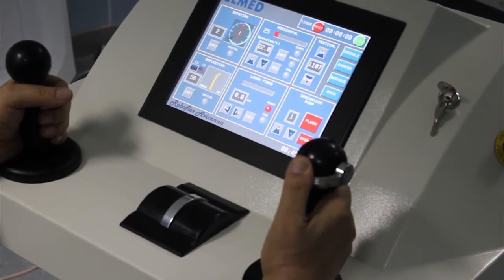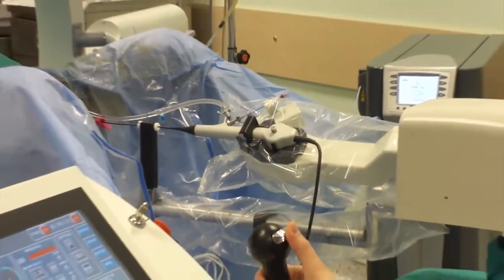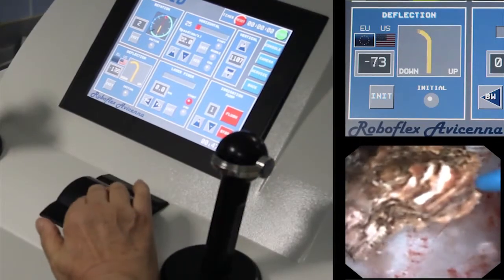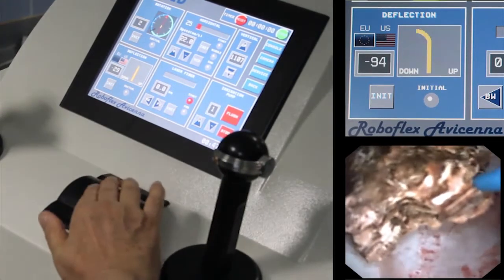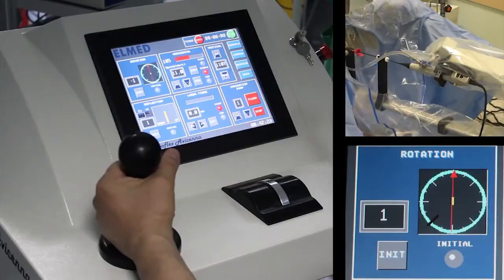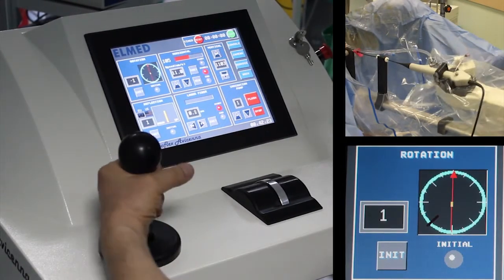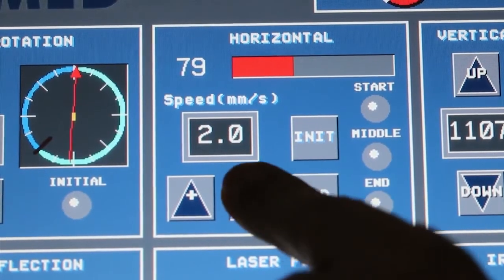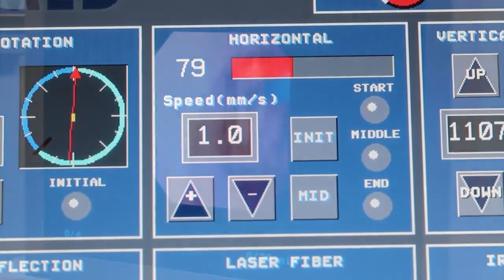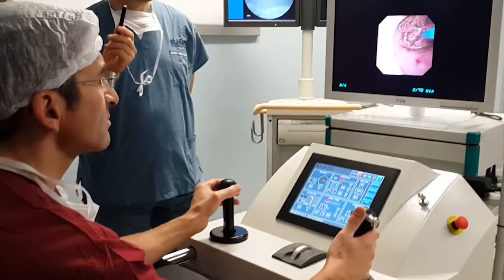The right joystick enables deflection and is designed similar to the handpiece of any standard flexible ureteroscope. Micromotors move the steering lever of the handpiece. For fine adjustments of deflection, a central wheel can be used, especially during precise systematic ablation of the stone. The left joystick allows for rotation of the endoscope as well as advancing and retracting the scope. The speed of rotation and advancement can be regulated on the screen of the console.